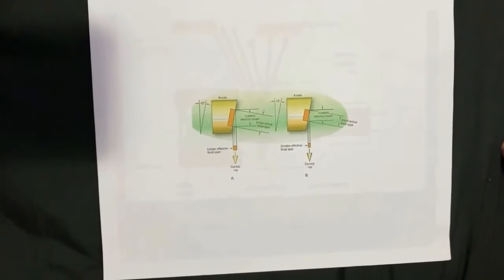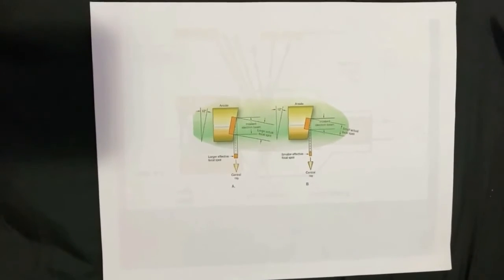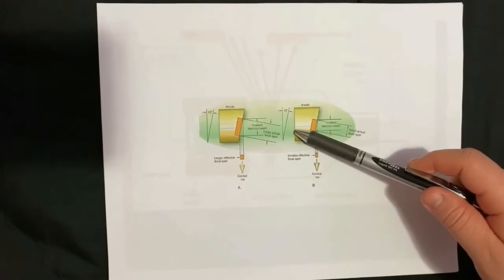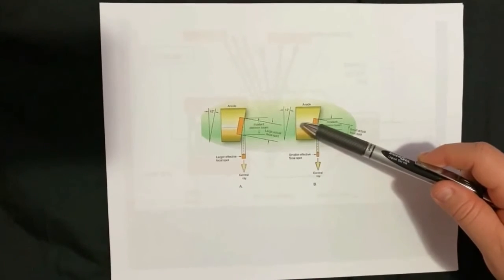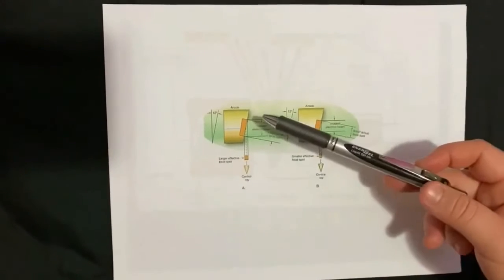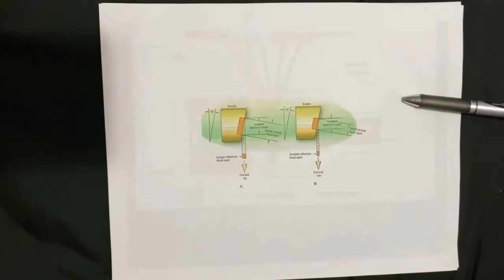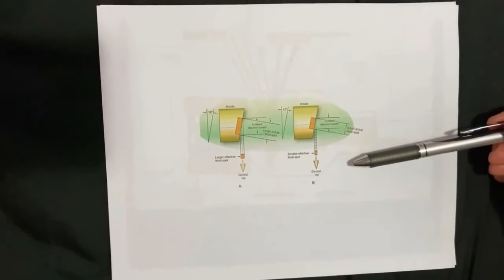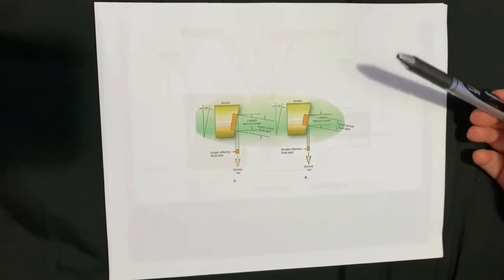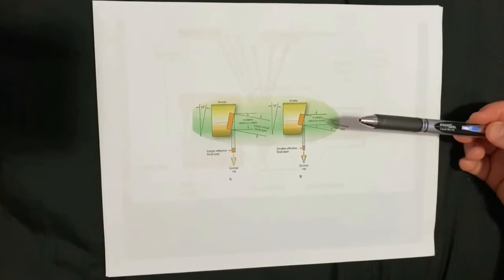Now we'll be talking about the actual focal spot and the effective focal spot. The greater potential difference between the anode and the cathode sides causes electrons to be pulled from the filament toward the anode disc. The exact spot where the electrons hit is referred to as the actual focal spot. The size of the focal spot is determined by the angle of the disc and the size of the filament in the tube. The effective focal spot is released outside of the X-ray tube and projected in the direction of the object or body that is being radiographed.